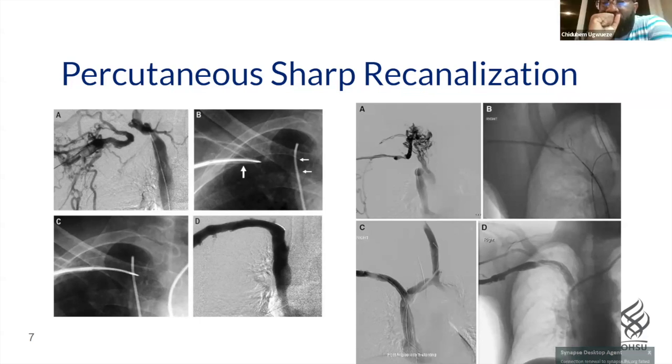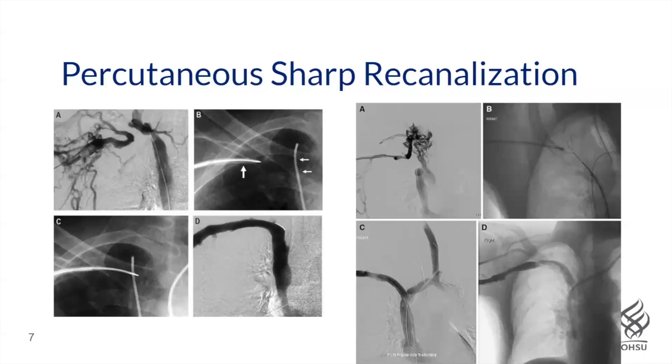When we are saying a short segment of stenosis, do we have a number, maybe 1 to 3 or 1 to 5, or is it just qualitative? And another question: when you are speaking about the percutaneous venous bypass, you mentioned accessing the brachial vein. Is it necessarily the brachial vein, or could we access even the basilic or the cephalic one?